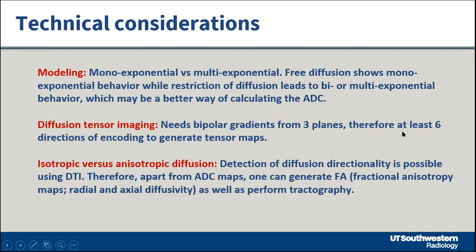So one of my collaborators, Dr. Gustav, I don't know if he's online, did a study some time ago, I think it was published in AJR 2010 or 2011, where they found that if you go above 20 directions, you don't gain much for MSK imaging. And the structures are simpler as compared to brain. So I usually use a medium number of directions since I started in 2009. I usually use 12 directions. On Philips, it's called medium level of directions, or 15. On Siemens, it's 12 directions. So usually 12 to 15 are good enough.